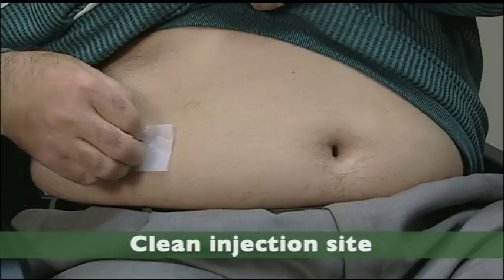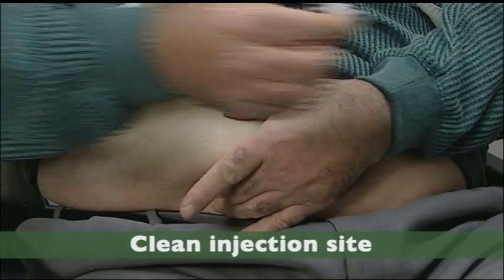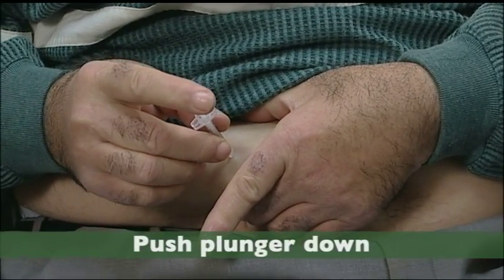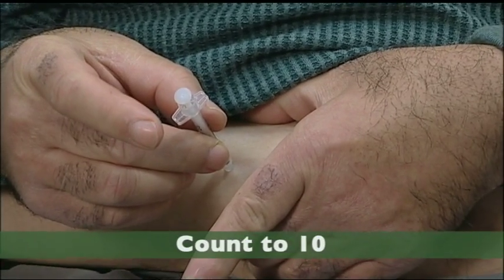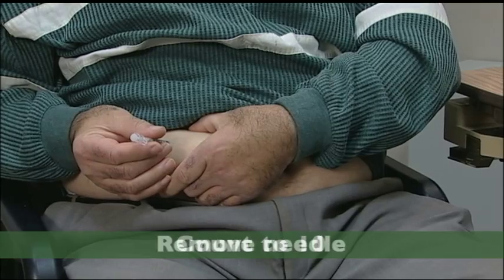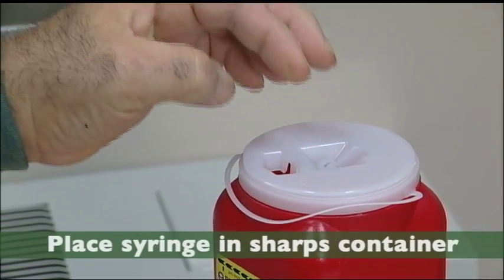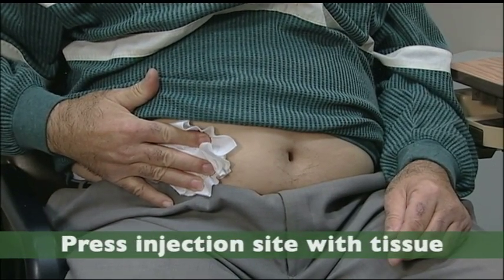First, clean the injection site by taking an alcohol swab or soap and water and wiping a two-inch circle around the site. Pinch your skin so that you'll be injecting into fat tissue and not muscle. Push the needle into the skin and push the plunger down completely. Count to 10 to make sure you've injected all your insulin. Remove the needle, release the pinch, and place your used syringe in the sharps container. With a tissue, gently press the injection site, but don't massage it.